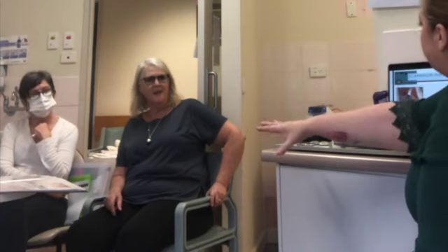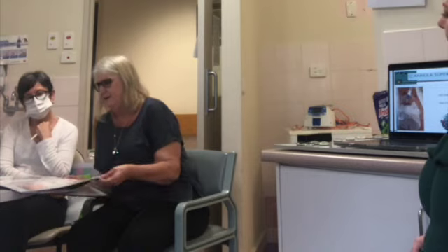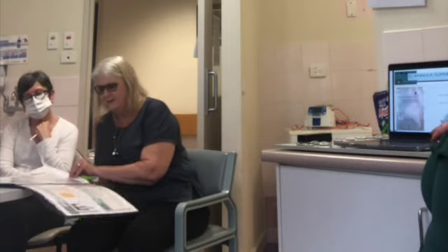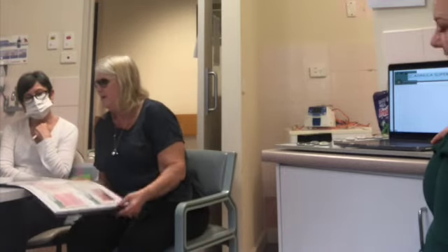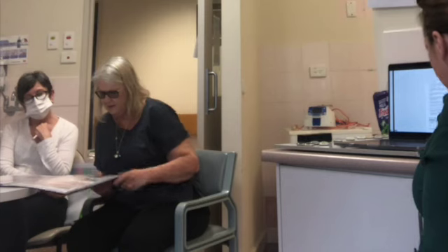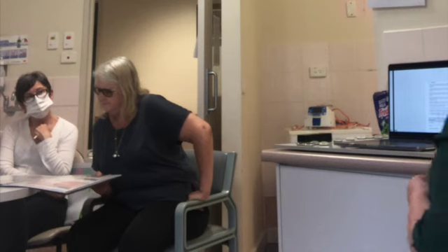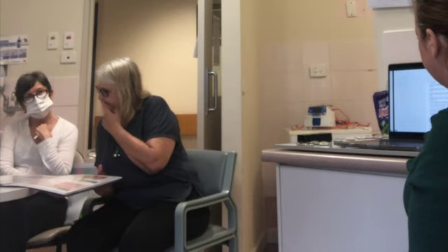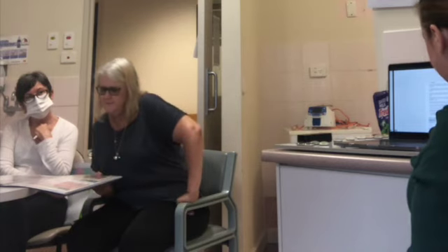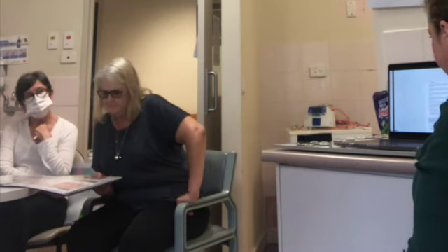So if you can't see this, the folders have got all the slides in them. We're just having a chat about cannula dressing and how we can do better. Speaking of the policy, I had a massive read so you guys didn't have to. It's a very specific point about dressings in section 5.7. Down the bottom here it says your transparent, semi-permeable, self-adhesive polyurethane dressing should be changed every 7 days or sooner if it is no longer intact, evidence of inflammation, or is moist.